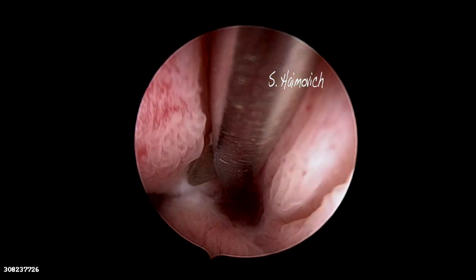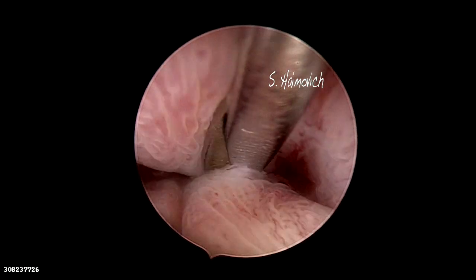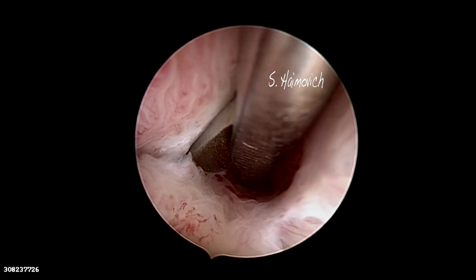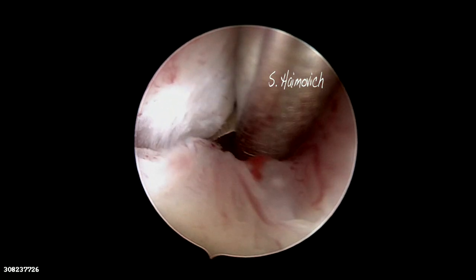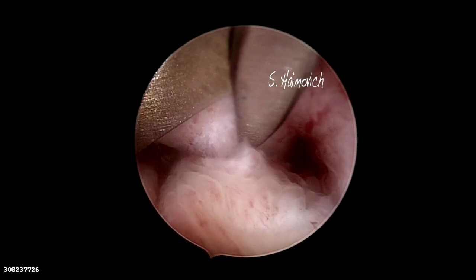We present a case of a very thick septum that arrived till the internal OS. The procedure was an office procedure that started without anesthesia. At the beginning, scissors were used but the tissue was difficult to cut due to the consistency.